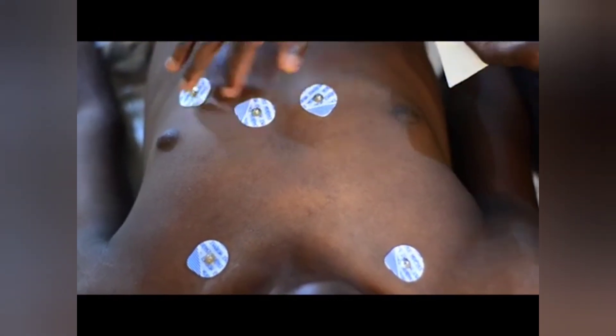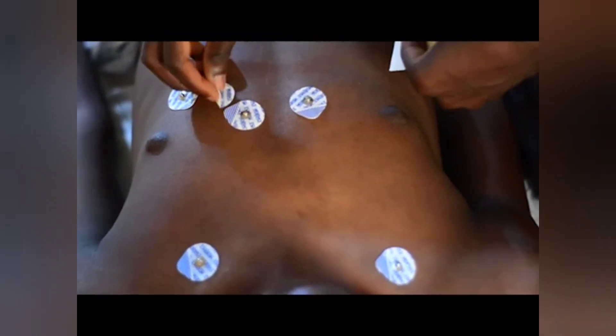V3 is placed anywhere between V2 and V4, so I place it midway between them. V5 is located on the anterior axillary line of the fifth intercostal space. V6 is on the mid-axillary line of the fifth intercostal space — on the same horizontal level as V5. That is where V6 is placed.